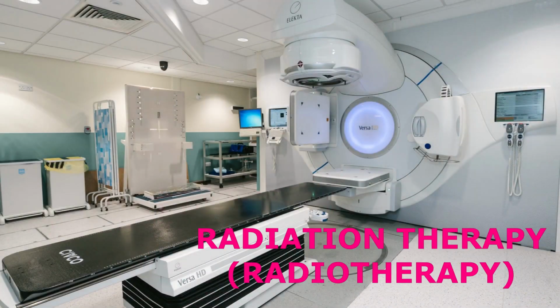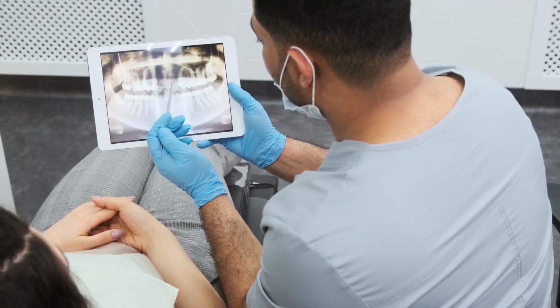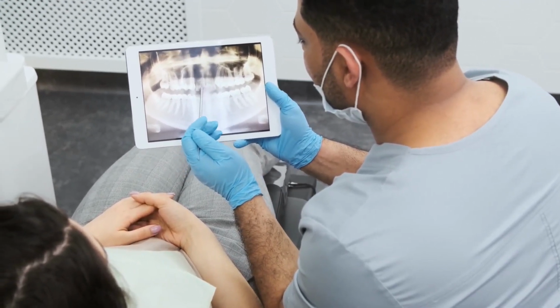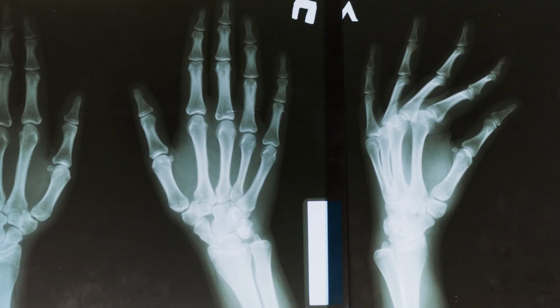Radiation therapy, also called radiotherapy, is a cancer treatment that uses high doses of radiation to kill cancer cells and shrink tumors. At low doses, radiation is used in X-rays to see inside your body, as with X-rays of your teeth or broken bones. In order to feel their presence, you need to detect them.